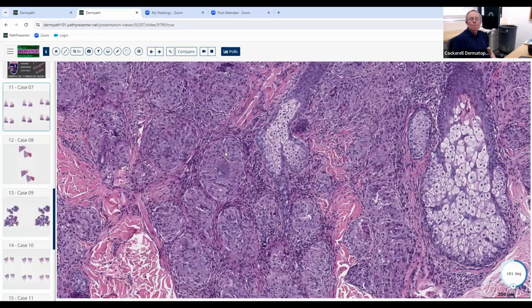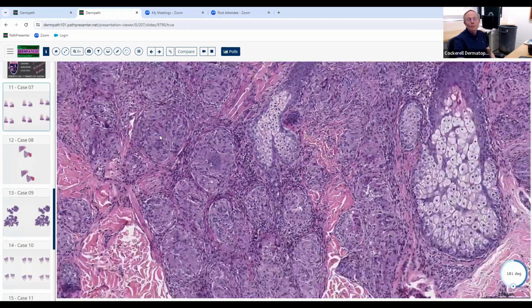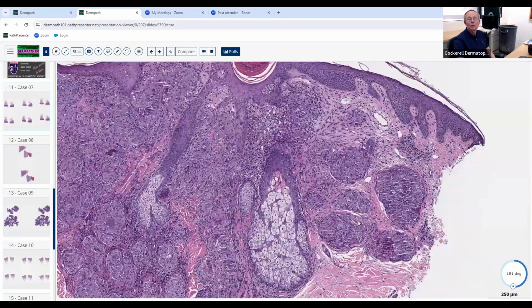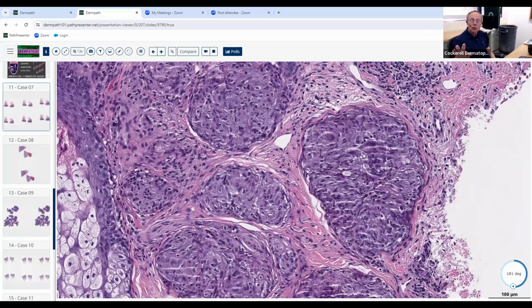If somebody had that much TB back in the days before they had drugs for it, they wouldn't survive. They basically had miliary tuberculosis, a widespread tuberculosis over their entire body and skin with such an overwhelming organism load they wouldn't live. They would have tuberculoid lesions like that with tuberculosis, but they wouldn't have the diffuse lepromatous pattern with TB, and patients wouldn't survive. So they just called this tuberculoid Hansen's when histologically it looks like sarcoid under the microscope, because they have a very prominent brisk reaction.